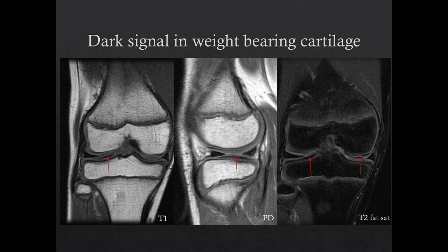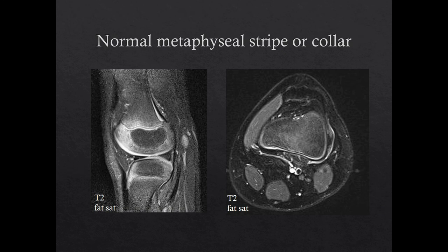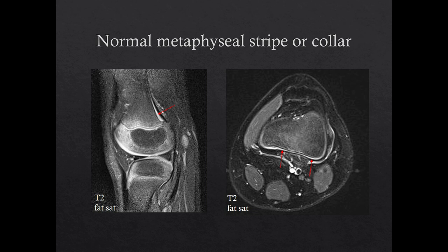Another normal variant is occasionally seen within the cartilage of weight-bearing joints in children, such as in this knee. Here you can see a dark band of low signal intensity, which can be seen on all sequences. This may be due to displacement of water in the weight-bearing portions of the cartilage. The periosteum is normally loosely attached to the long bones in skeletally immature children, except at the physis, where it is continuous with the perichondrium and is more tightly attached. The loose attachment of the periosteum explains why children develop subperiosteal collections, such as subperiosteal abscesses with osteomyelitis or subperiosteal hemorrhages after trauma. However, there is a normal layer of fibrovascular tissue between the periosteum and the bony cortex of the metaphysis, which demonstrates high signal on T2 and enhances after gadolinium. This is referred to as the metaphyseal stripe on sagittal images or the metaphyseal collar on axial images, and disappears after physeal fusion.